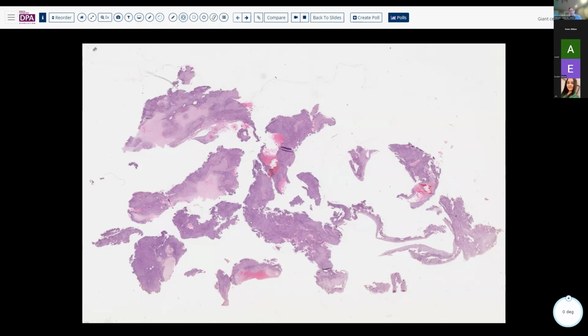I have about 9 or 10 cases that I have come across again recently. The backdrop here, of course, is that I have a few gray hairs and I realize that I'm not going to be around forever. So I've been culling through my collection of glass slides for the last 30 or 40 years to pull aside some of the best ones and to get them digitized so that they can be a lasting benefit.